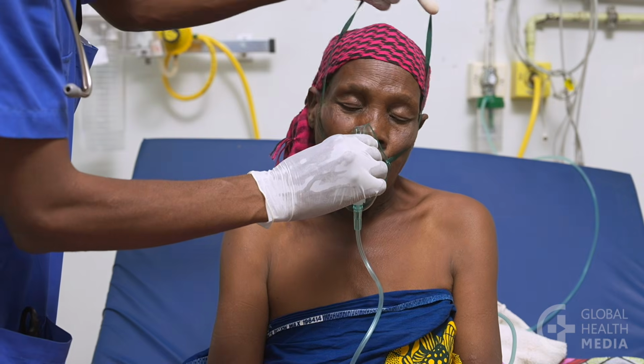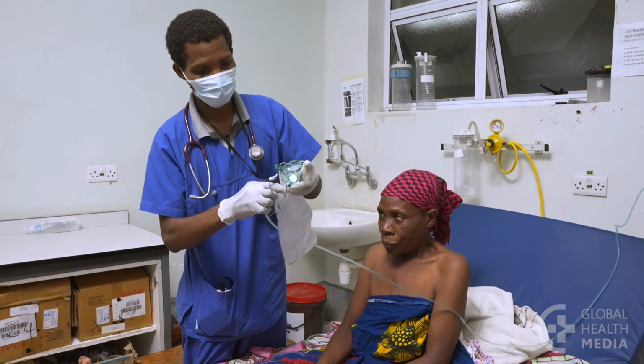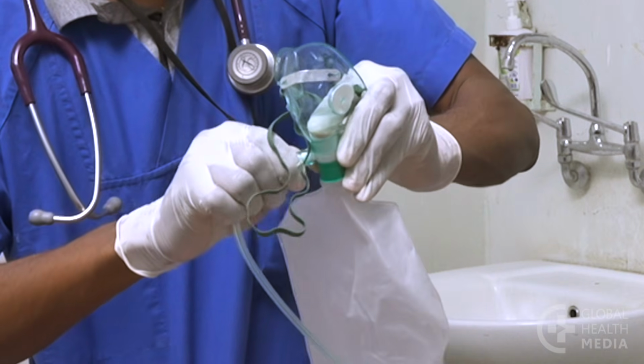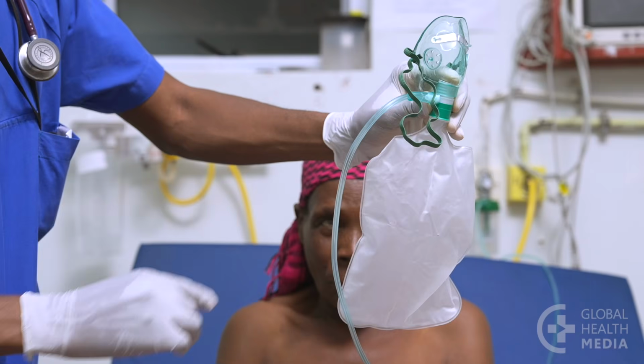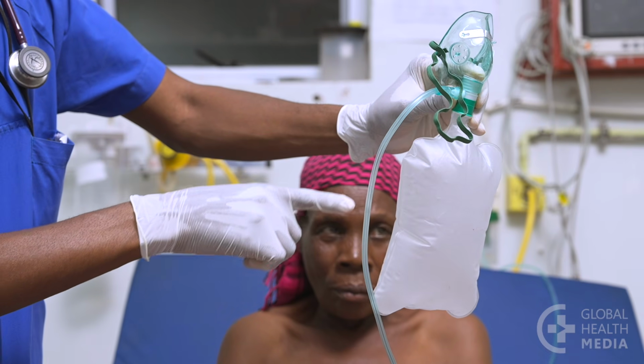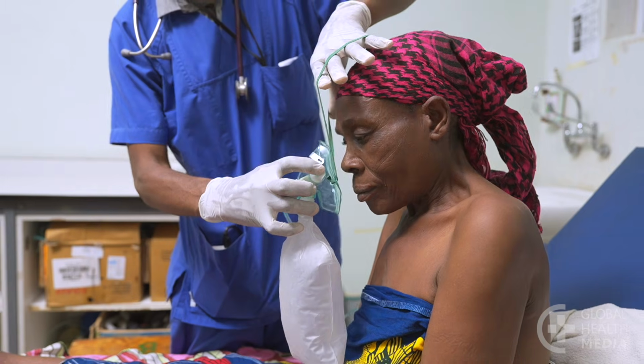To prepare the non-rebreather mask, attach the oxygen and put one finger over the valve at the top of the reservoir bag to inflate the bag. Always inflate the bag and connect it to oxygen before placing the mask on the patient.